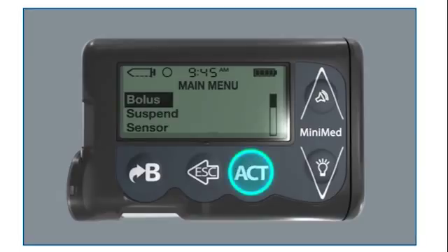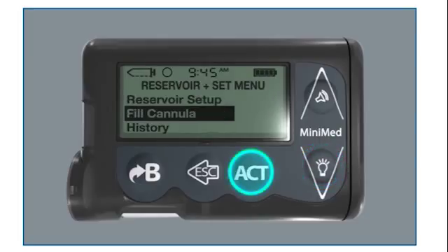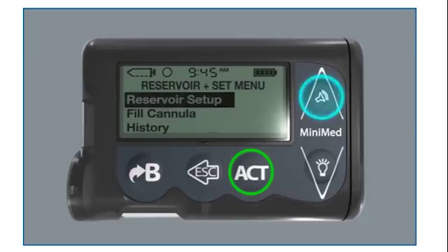Press Act to get to the main menu. Select Reservoir plus Set and press Act. Select Reservoir Setup and press Act.